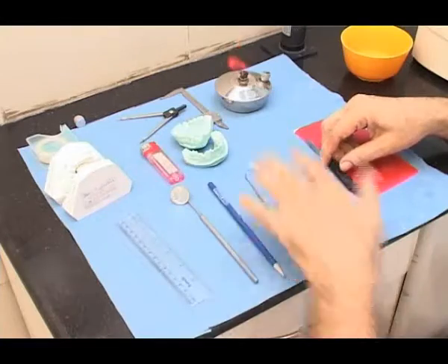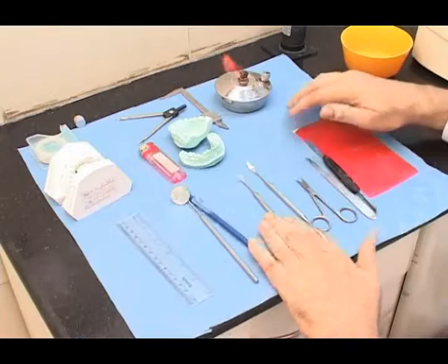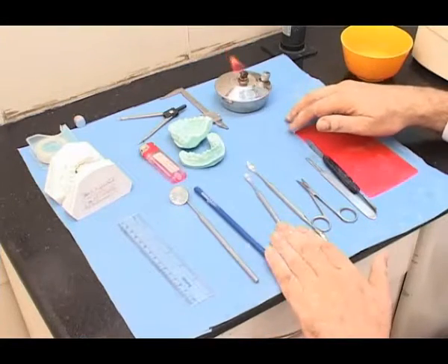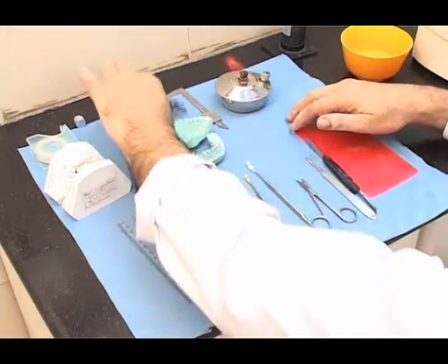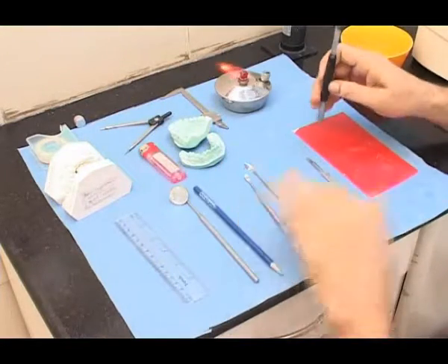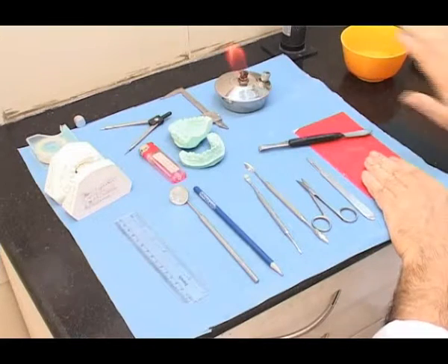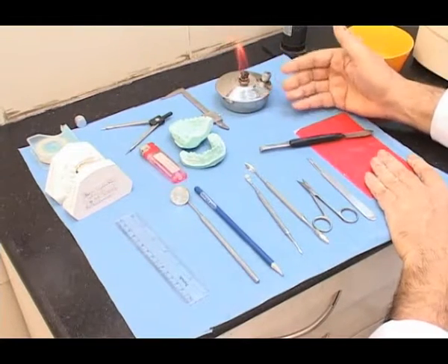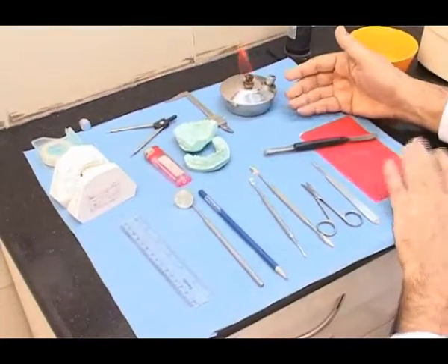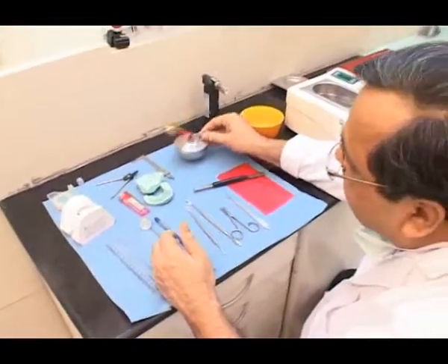The tray setup for recording the bite — as you can see — it is a good idea to keep everything handy. The important items are the measuring instruments, the ruler, the wax bite, the wax sheet, hot water and cold water. Your spirit lamp should always be kept away from the patient, and if you are using a spirit lamp, make sure that you have enough spirit in it.